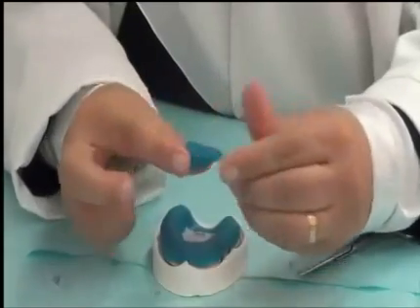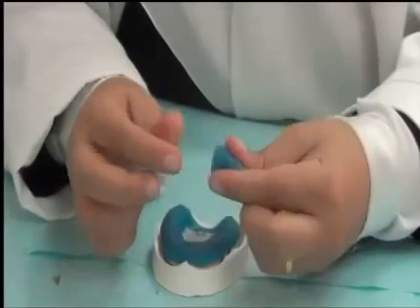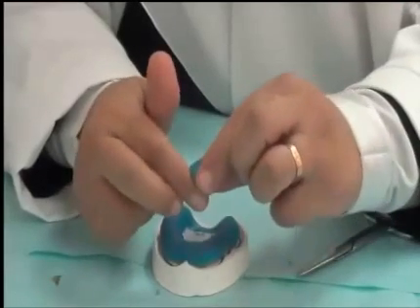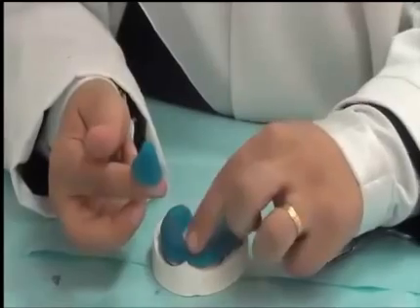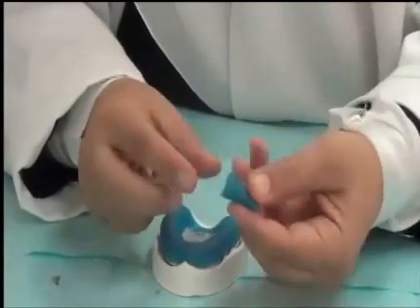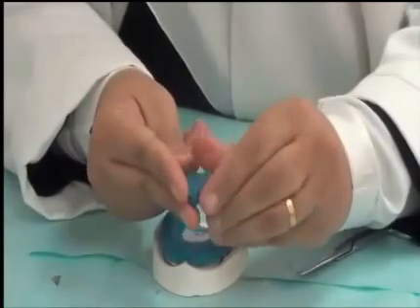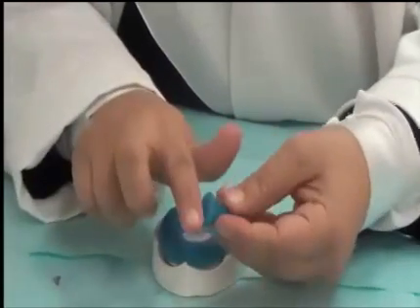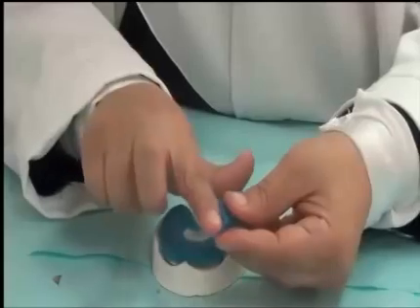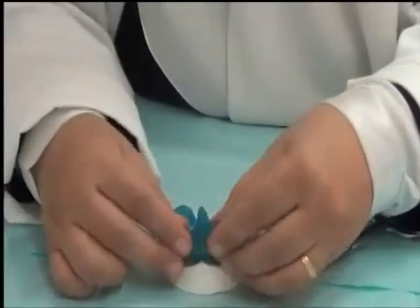We make the base a bit wider than the upper part. This will allow us to adapt the tray handle to the tray body well. So, first of all, we made it wider from the base than the tip of it, and we press it like this, so we could adapt this easily to the tray from beneath.